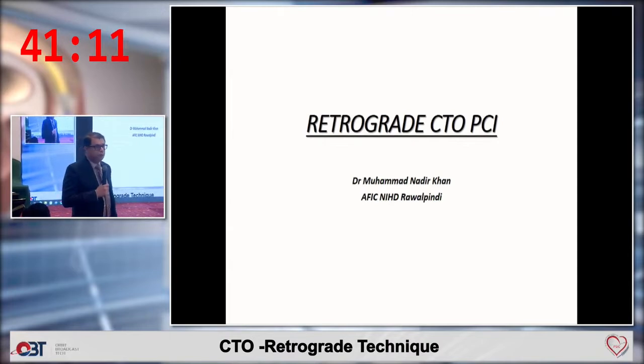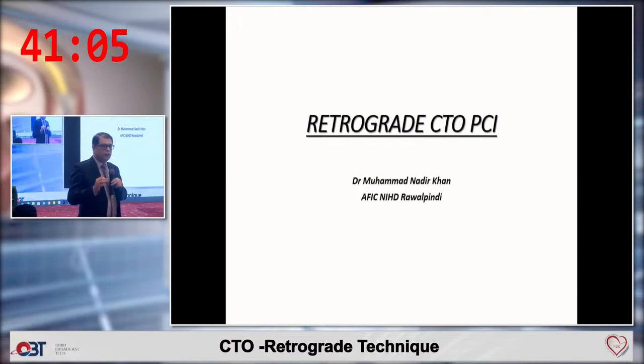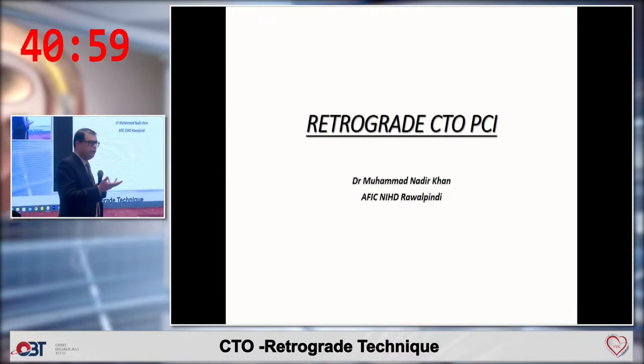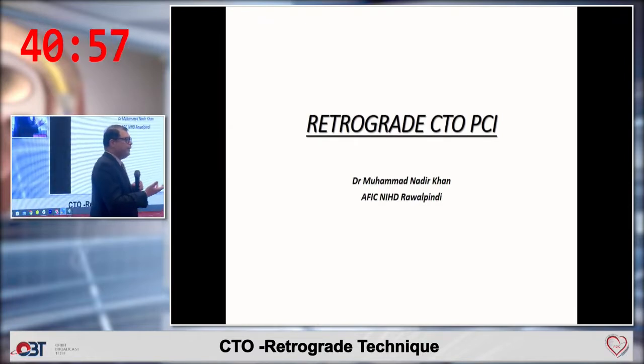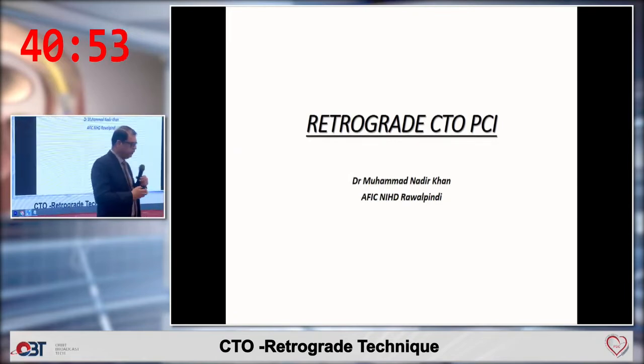Yes, very important. You should have covered stents and coils of all sizes, and you should be familiar that the coils you are using are compatible with your microcatheters. And most of the coils we use with FineCross or Caravel, so the coils that we have are usually compatible. The Cook coils are usually compatible.